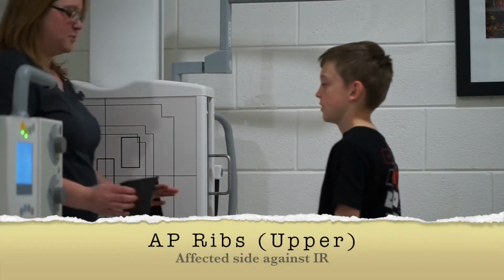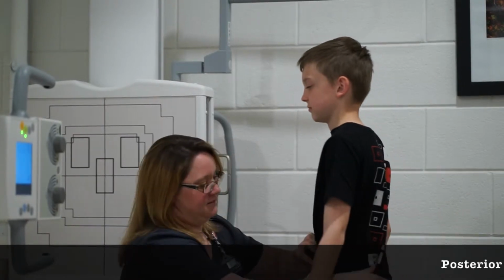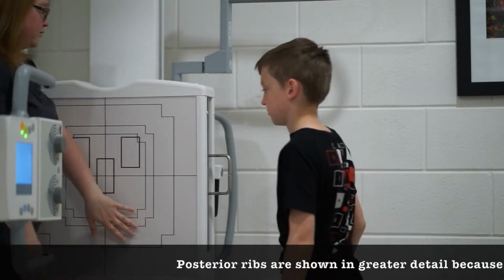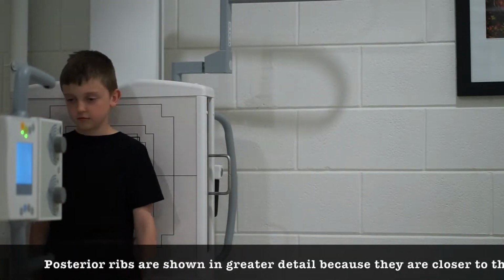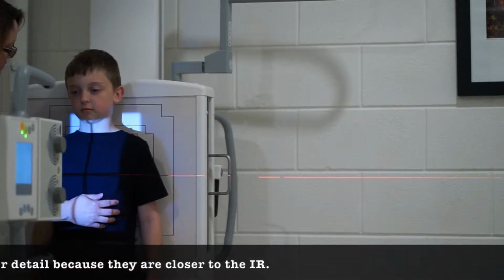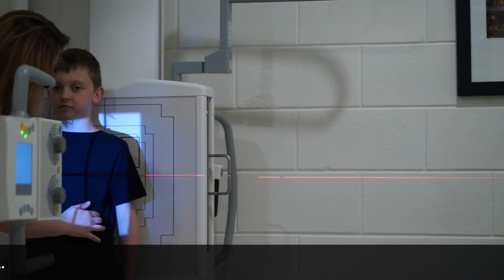Okay, Luke, I'm going to put this shield on you, okay? All right. And now I want you to come over here and put your back against the board. Take a step towards me. There we go.